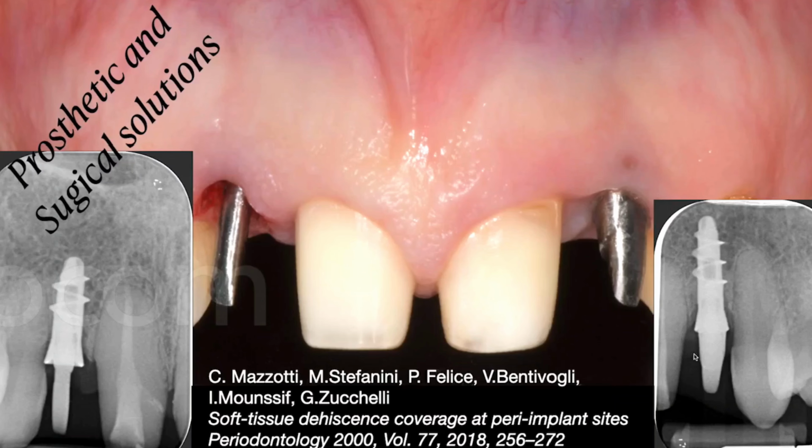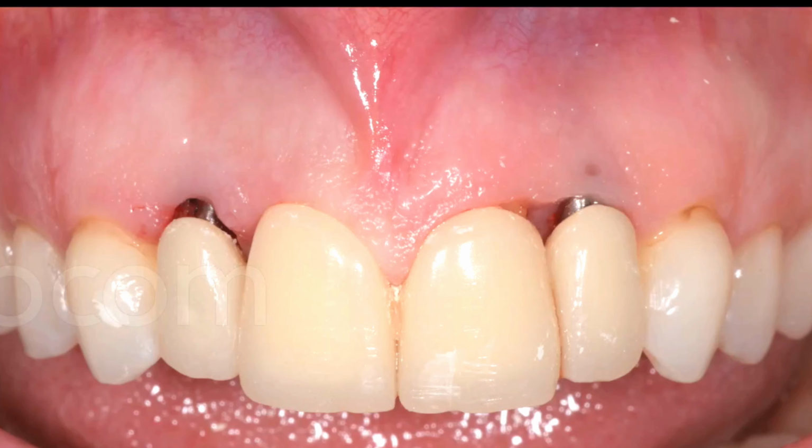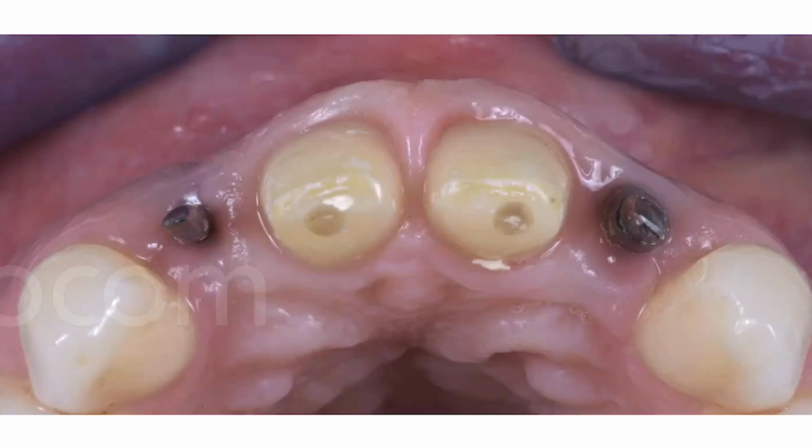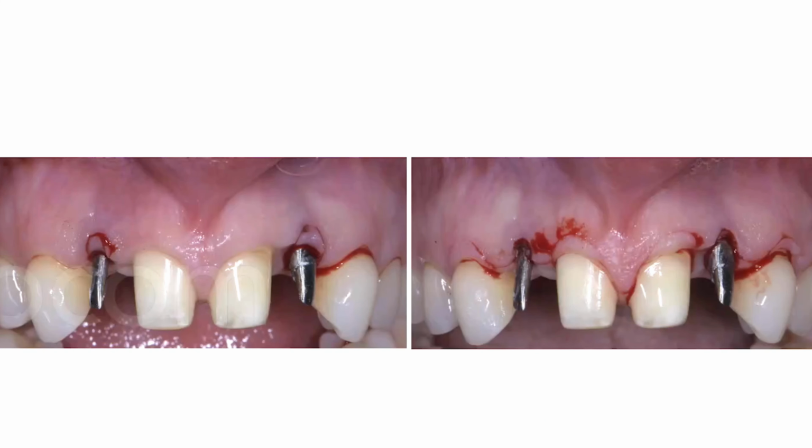So the distance between the abutment and the adjacent natural abutment is increased so much that now we can gain soft tissue. Remember, the crown and the tooth were attached. Now we reduce the abutment of the implant, we reduce the abutment of the tooth during the preparation, so there is 1.5, more than 1 millimeter of soft tissue isthmus. And when there is 1.5 millimeters of soft tissue isthmus, we can work surgically. You leave this isthmus to heal completely for at least 6 months. And now we can work surgically.